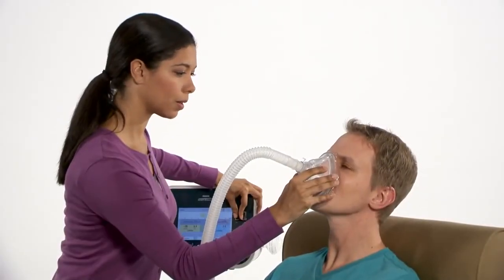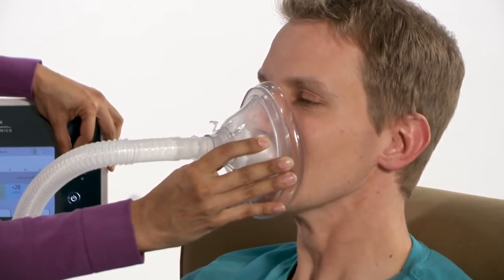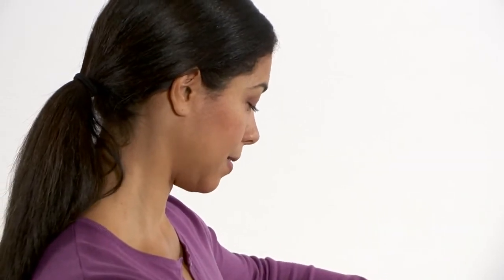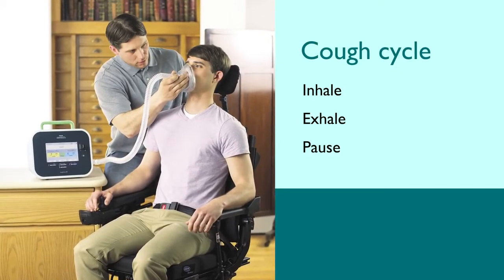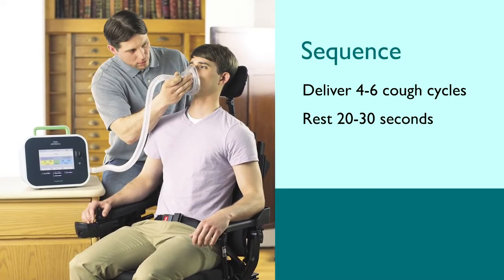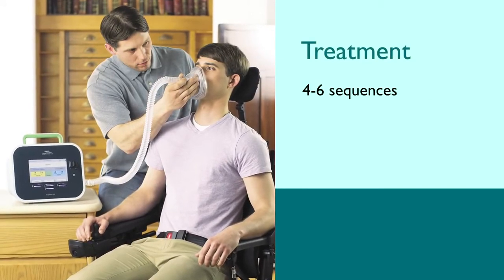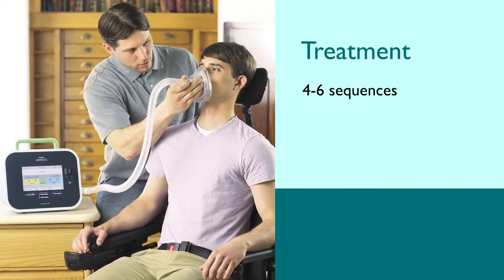For the initial treatment, you may want to begin with lower pressures to give the patient a chance to get comfortable. You can gradually increase pressure as described in the pressure and timing adjustment portion of this program. A cough cycle is defined as inhale plus exhale plus pause time. Deliver 4 to 6 cough cycles in rapid succession, followed by a rest period of 20 to 30 seconds. Repeat this sequence, 4 to 6 cough cycles and rest period, 4 to 6 times for a complete treatment.